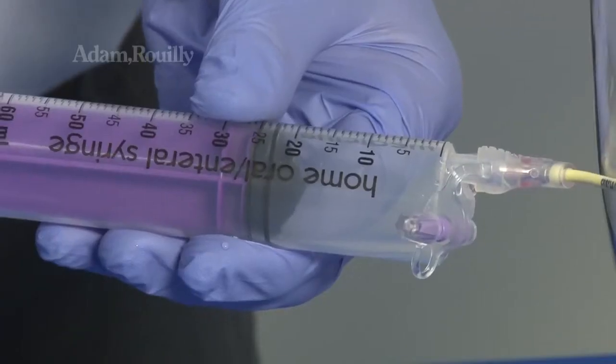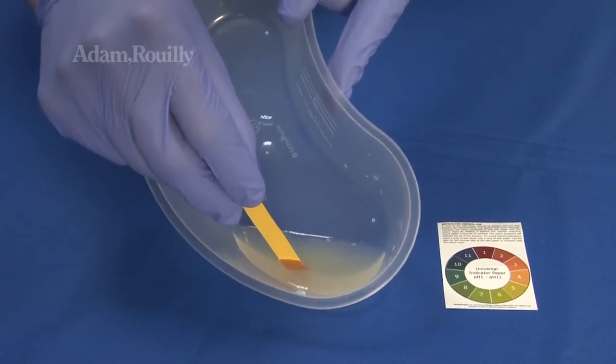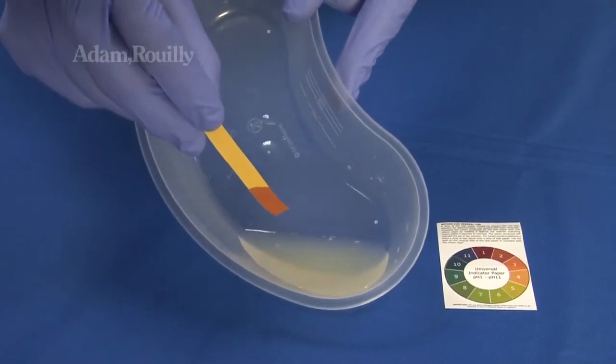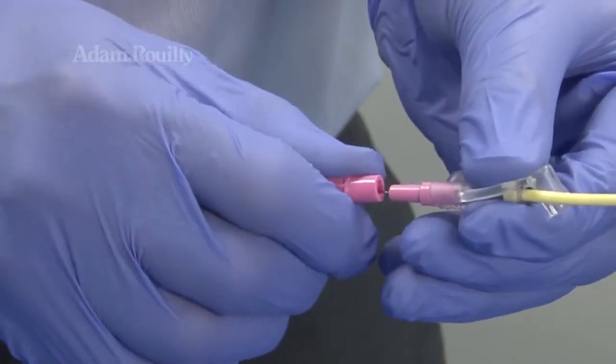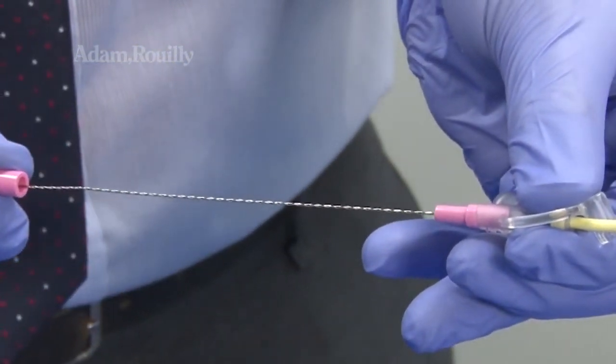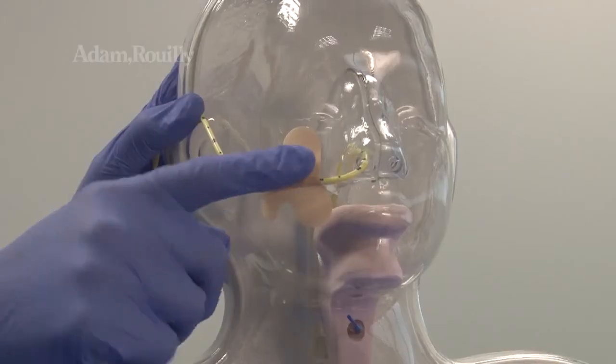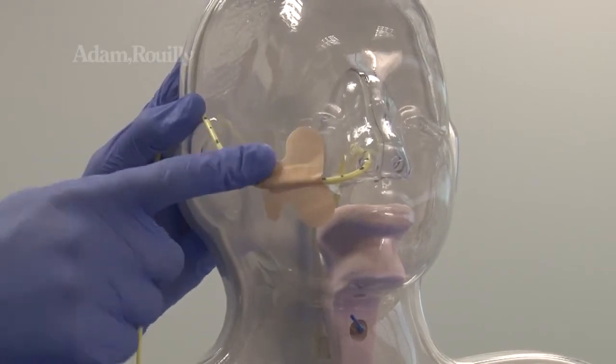Stomach aspirate can be withdrawn and pH tested to confirm placement. Guide wire removal can also be performed and adhesive dressings can also be applied to the model.